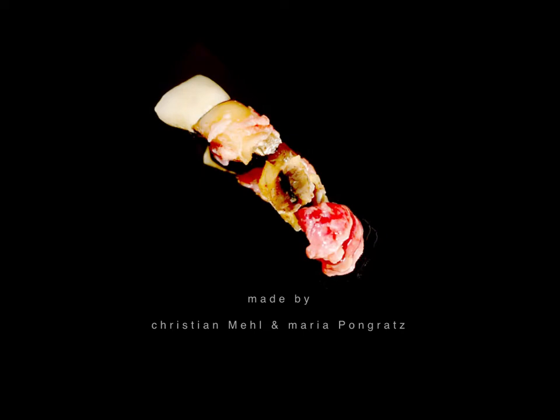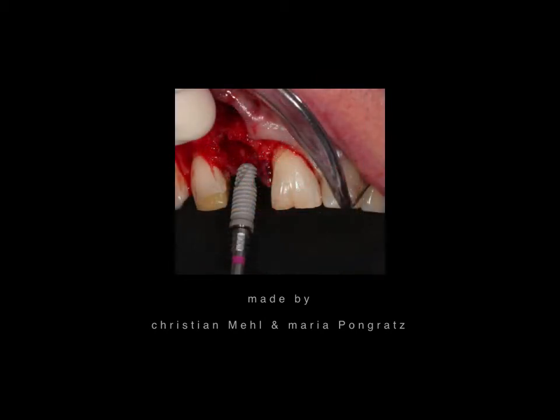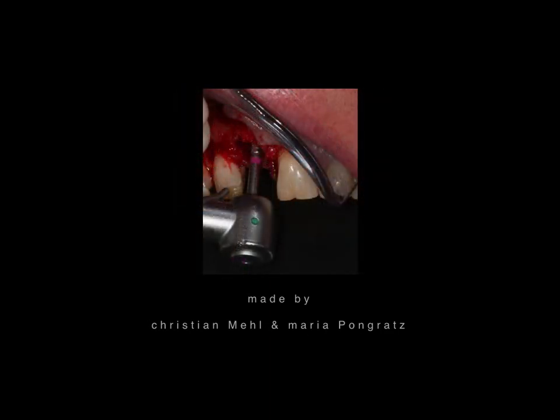This is a tooth with an insufficient crown, vertically fractured, with a metal post exposed to the bone. Of course, that results in inflammation. Then preparation for the implant, in this case very easy because we have perfect sight. And then placement of the implant.